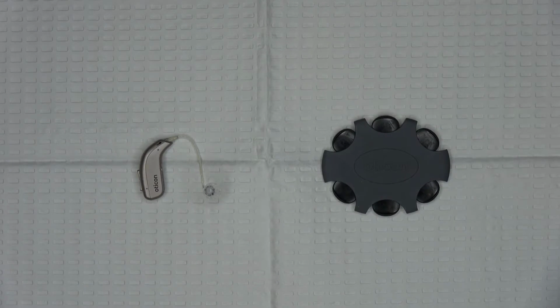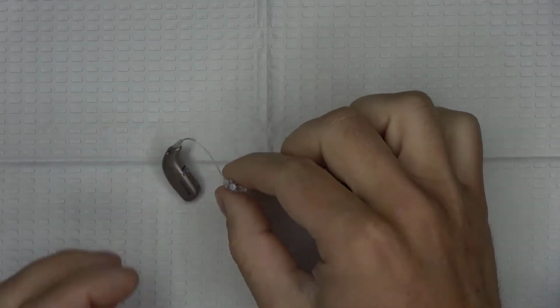The process of changing the wax guards, regardless of whether you have Pro Wax or Pro Wax Mini Fit wax guards, is exactly the same. But it is good for you to know which wax guard is specific for your hearing device. So without any further ado, let's get started on changing some wax guards. All you will need for this procedure is the device itself and the pack of wax guards, which look like this. I always start by examining the device and the receiver.